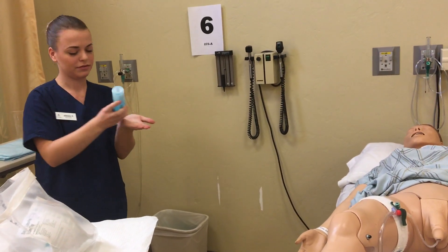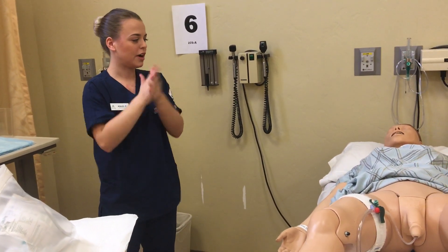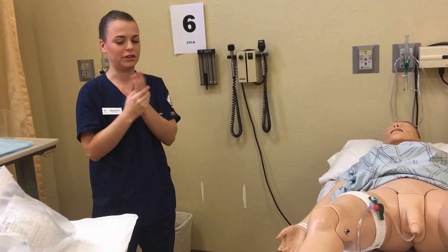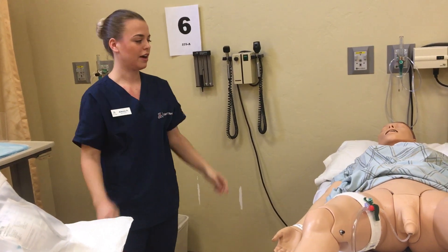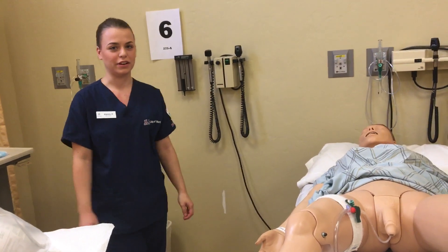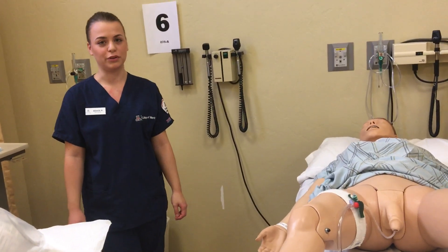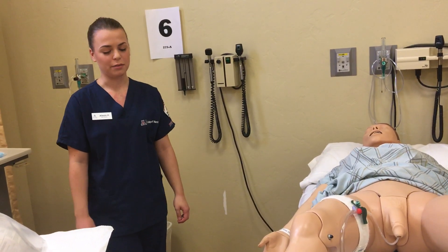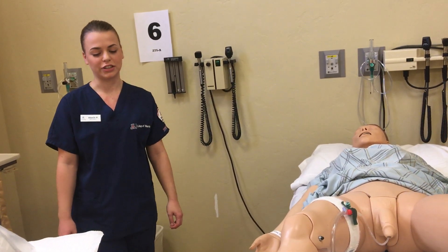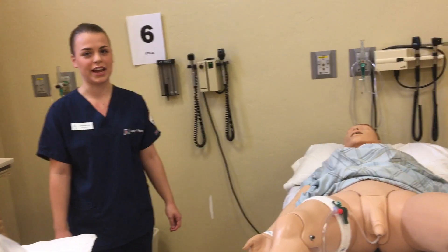How was that for you? That was fine. At this time I would lower the patient into a comfortable position, lower his gown and lower the bed. I would make sure he's in a safe position with his side rail up and has his call light. Then I would begin documenting that I inserted a size 14 French catheter, inflated the balloon with 10 cc's of sterile fluid, that the patient tolerated the procedure well, and the characteristics of urine if there was any — which would be the amount, odor, color, clarity, and consistency.